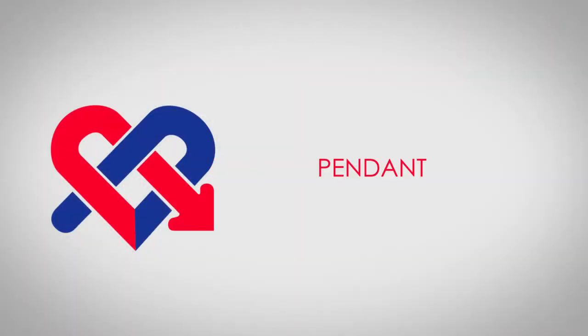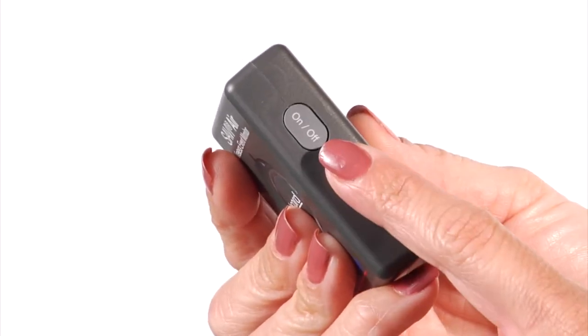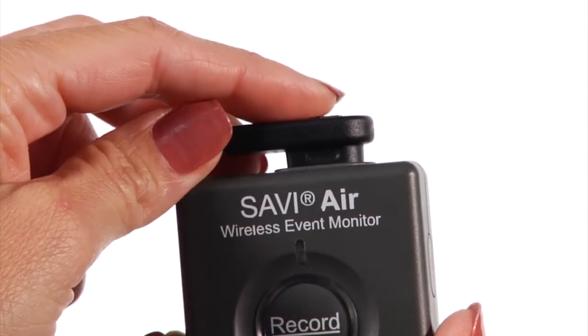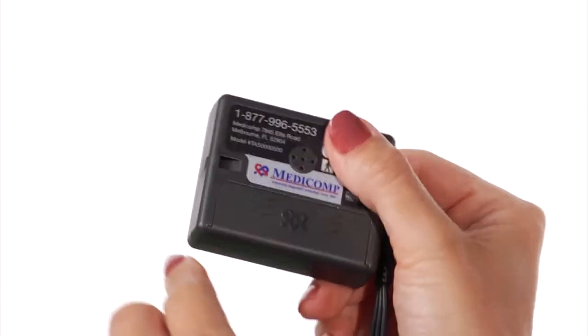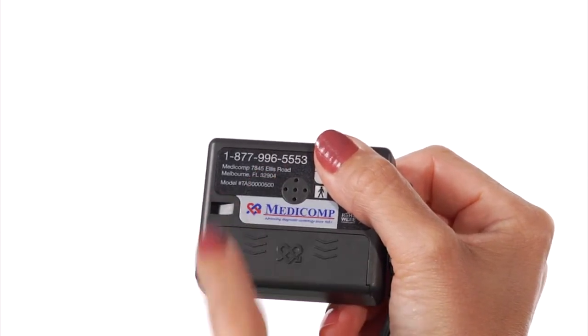Now let's become familiar with the Pendant. The Pendant has an On/Off button, Record Send button, Patient Cable Connector, and Lanyard Hook. On the back, you'll find the battery compartment and the toll-free number to the Medicomp Cardiac Monitoring Center.